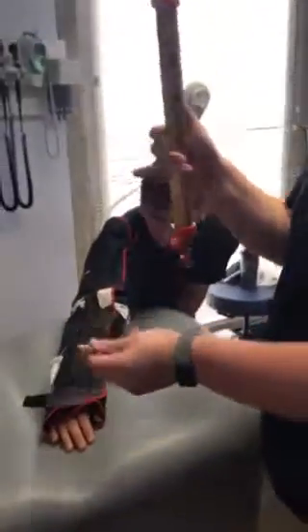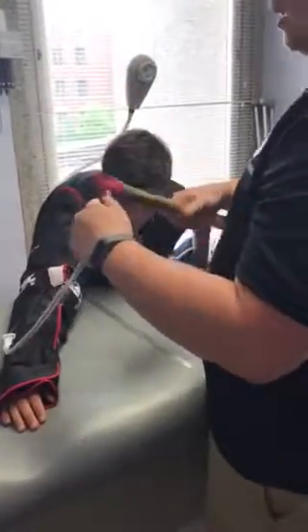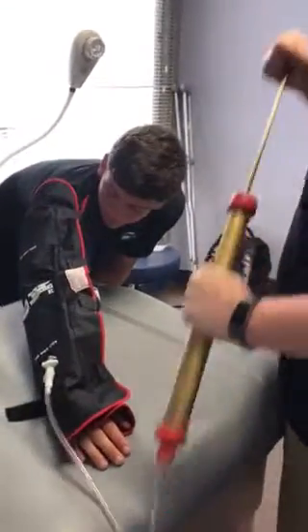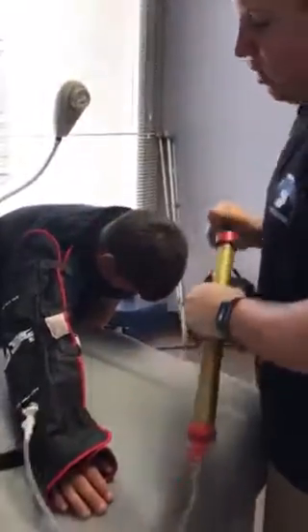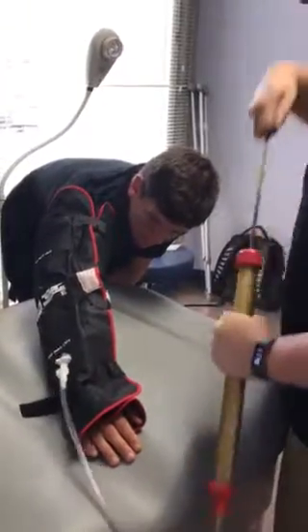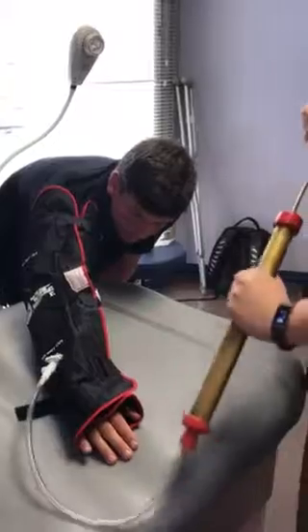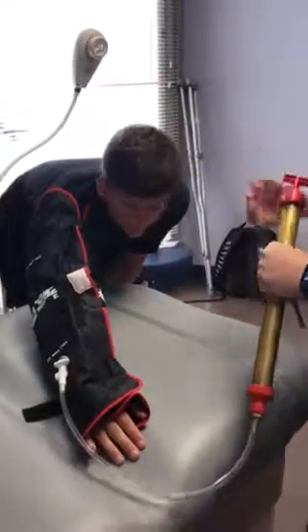That's good. Okay. You're going to get a pump that comes in the bag. Most of these will be on the sideline in with the kit. You're going to find whichever end sucks the air out. Attach the hose. You're going to start pumping. As you can see, the splint starts to decrease in size. You'll start seeing a more rigid edge along the splint. Once the pump starts to feel tight, as if you can't pump it anymore, go ahead and stop.